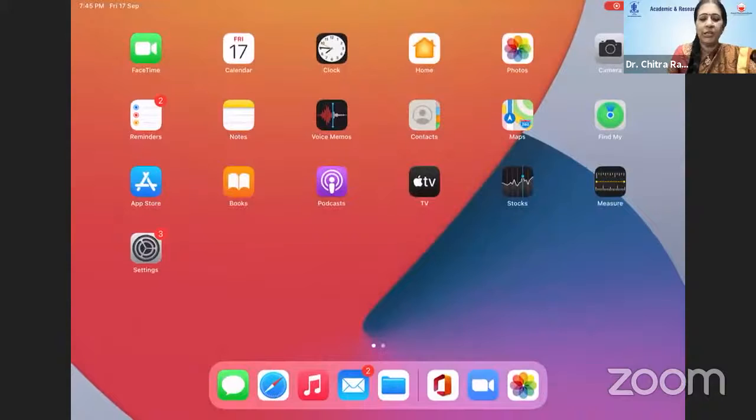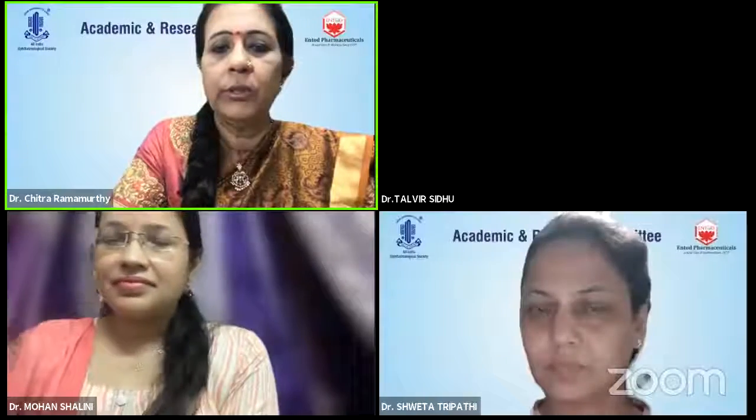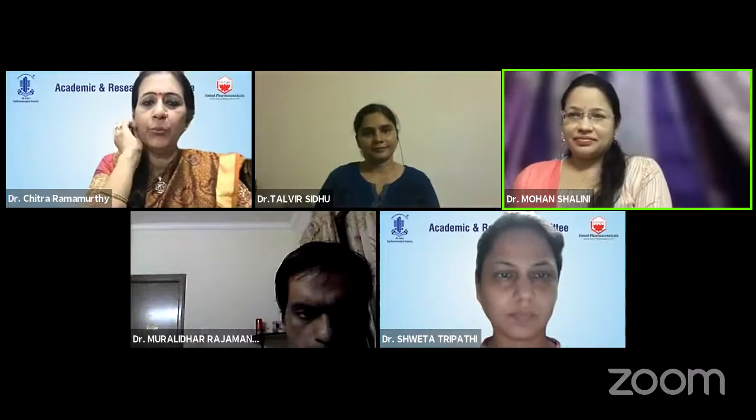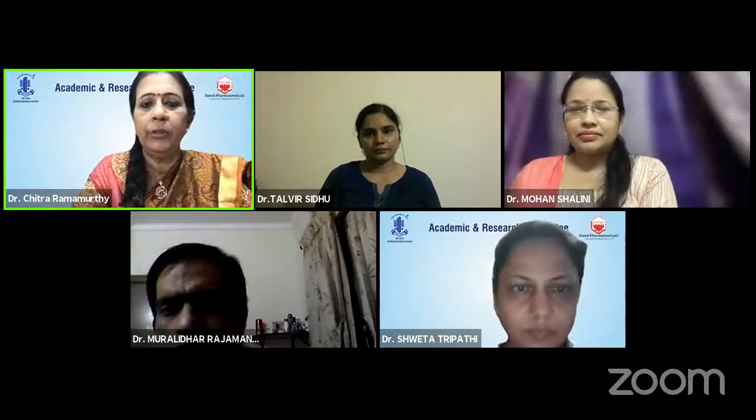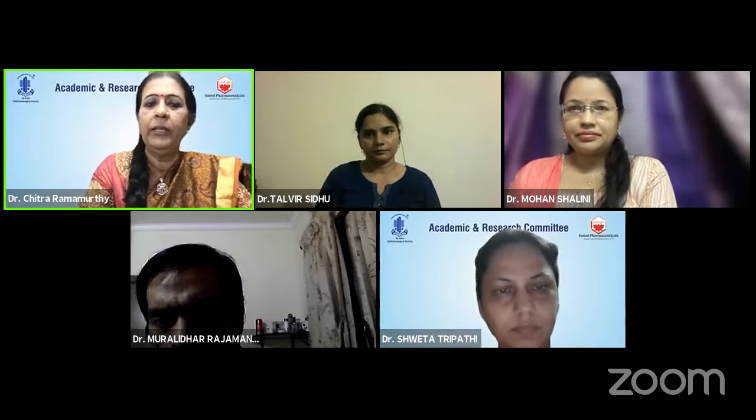Wonderful video, Dr. Shalini. I would want Dr. Shushmita to answer, or Shalini herself. How would you deal with a post-op IOP spike? Because some of the fibroproliferative material or any debris could reflux into the tube.